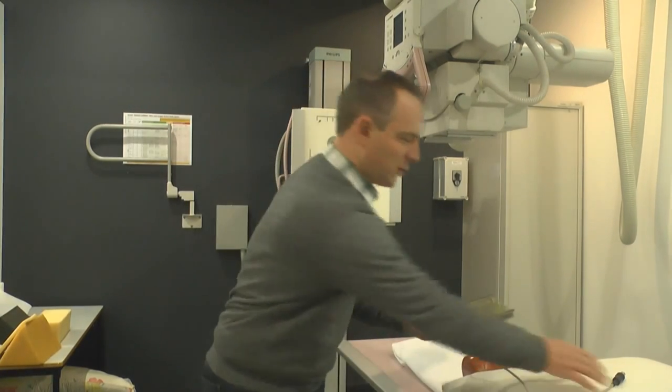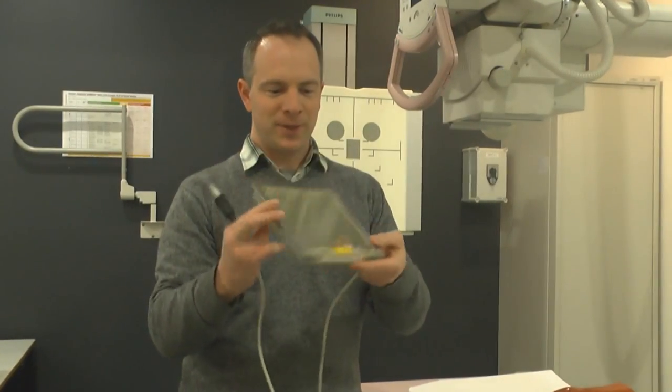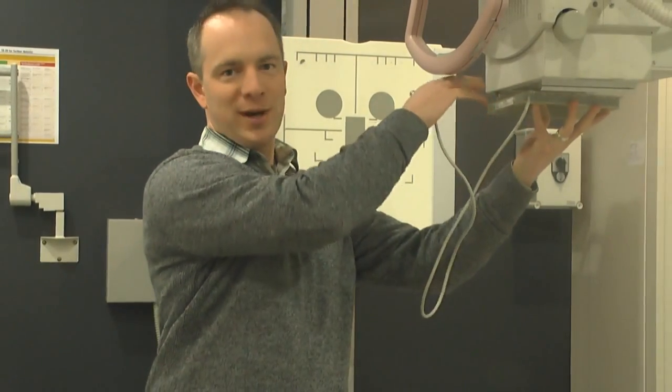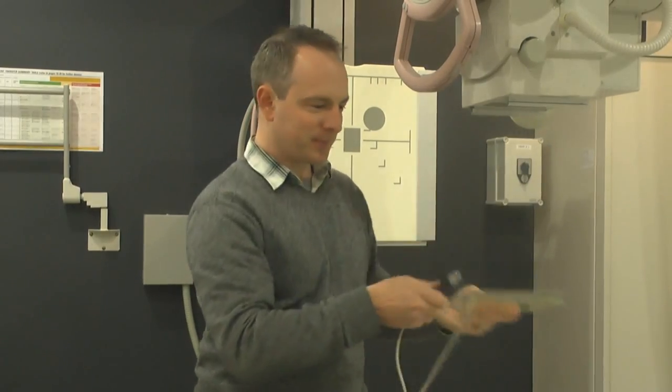Okay, so firstly we're going to be looking at how to measure the dose using the DAP meter. So this is what our DAP meter looks like, and it basically sits just underneath your X-ray tube, just like so, and the X-rays go through the DAP while you're exposing the patient.